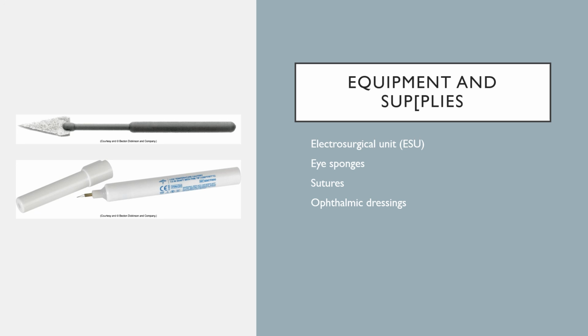And that is because we're going to be doing a lot of circumferential incisions that need to be closed. Okay, those needles are going to be just as fine as the sutures, some as small as 4 millimeters at their widest points, so very fine needles. And again, these should never come in contact with our cloth towels. We do not want to risk any kind of lint getting into those sutures.